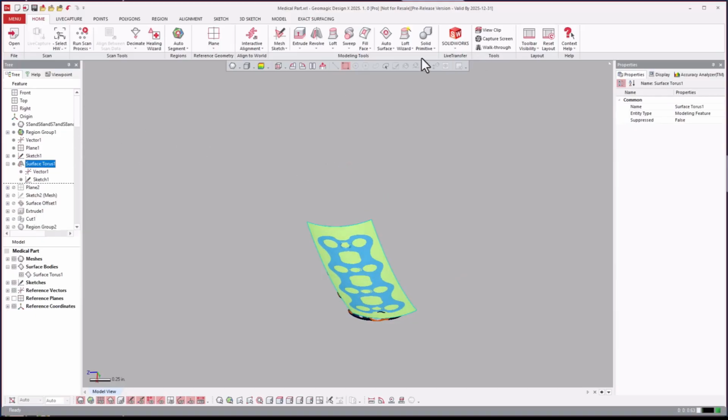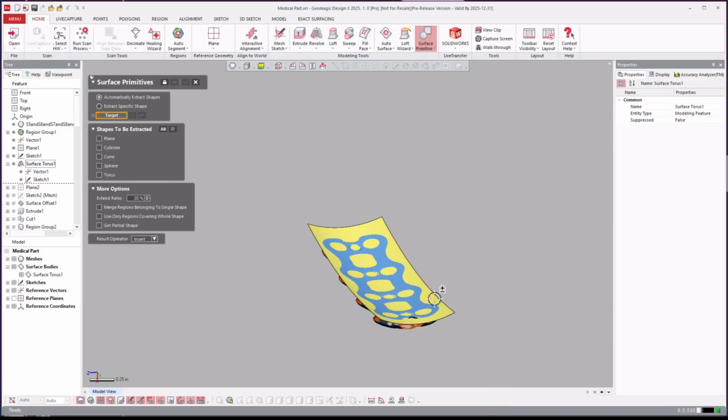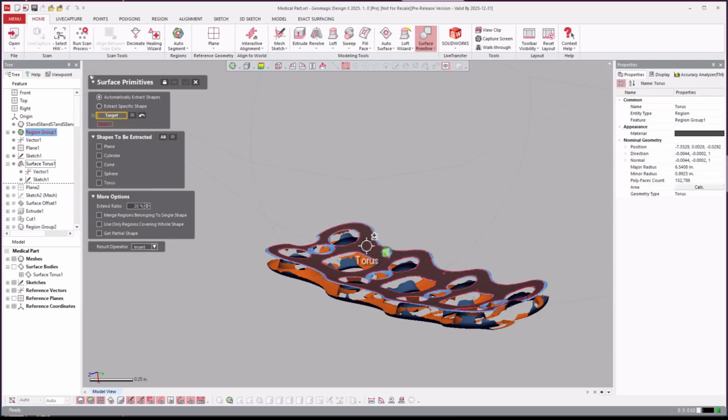And because it says surface torus, it means that they probably used a primitive here. So if you come over and you see here that it says torus, you can select a boundary or a region of a mesh and say you have to fit a torus to that, and it will fit it automatically to it. So you can select that, and if you turn on regions and we turn off that surface, I can click on that torus, and you see as long as the geometry type is set to torus here, and the scan data is accurate, it should recognize it properly.